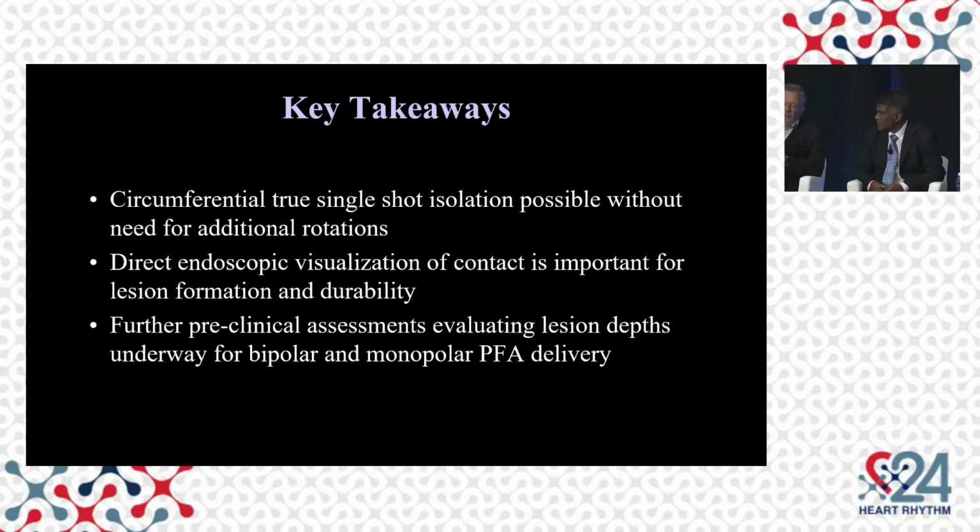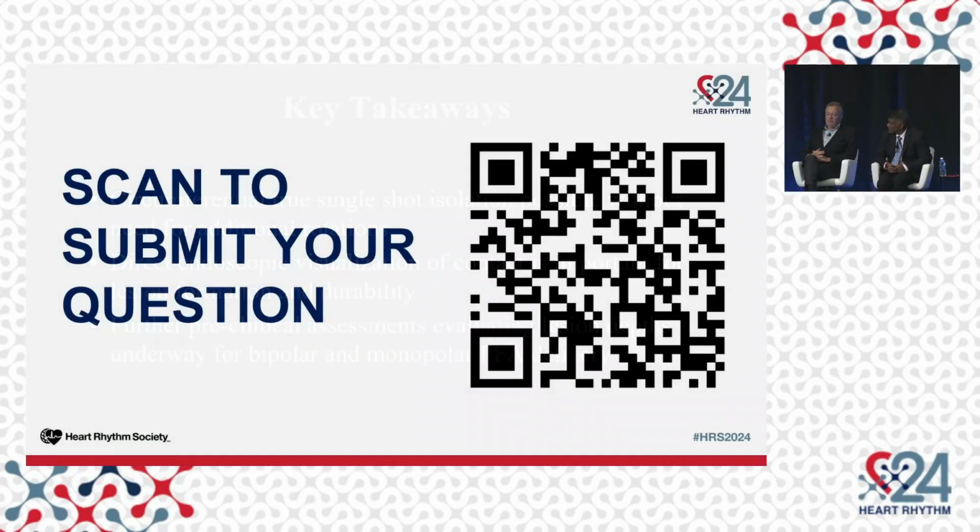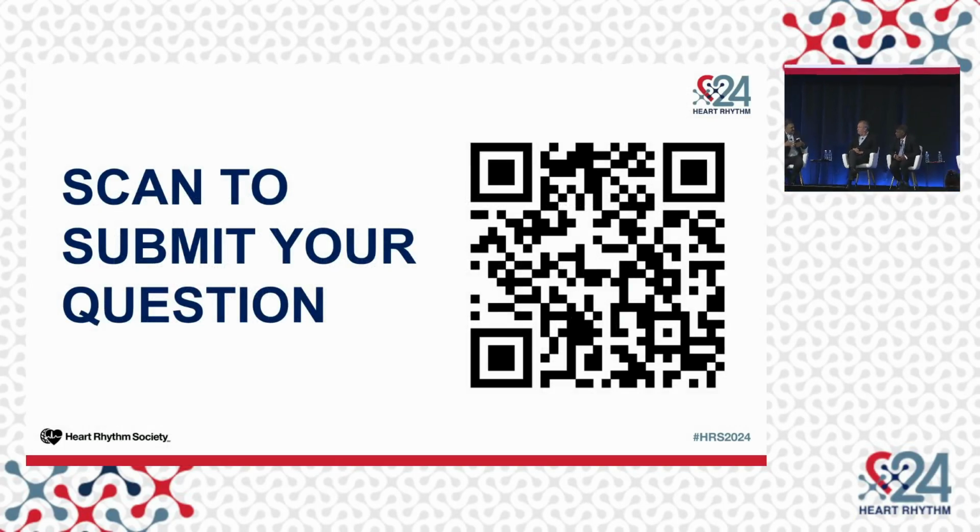Just a question and a comment. So I think one of the things that everyone's kind of getting fearful for is the hemolysis issue with PFA. And when you have electrodes, regardless of the fact that they're facing internally, the electric field goes behind it, and you have interaction with blood, even on one side that's not making contact. Do you think there's any potential advantage when you're in a balloon type shape because you don't have blood on the other side of the electrode? Potentially this could have a positive effect in decreasing hemolysis.